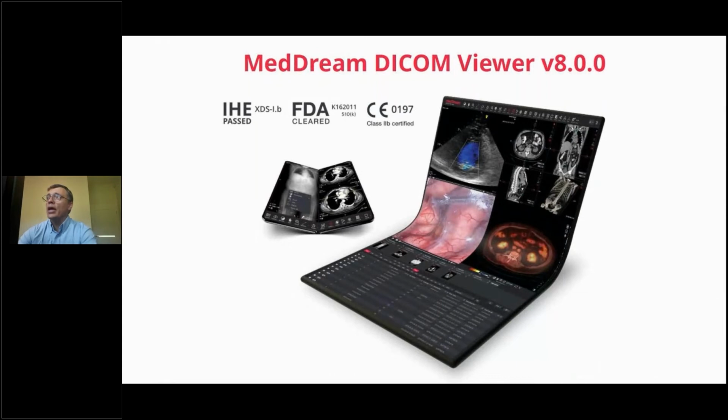From 7 to 8, I would say it was a turnaround of our product, a turnaround of performance, the most important, because what changed from 7 to 8, I believe, is speed, and most of our clients felt it. Another part is hanging protocols, tools, and flexibility to configure MedDream. Of course, security too. These changes are critical ones, and they show us where we are going.